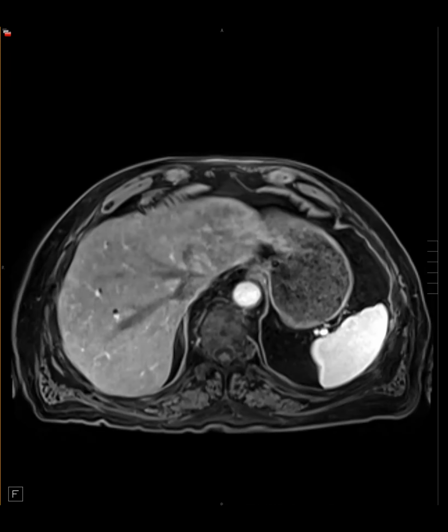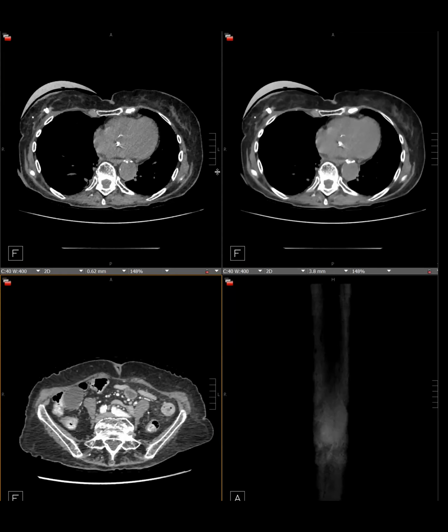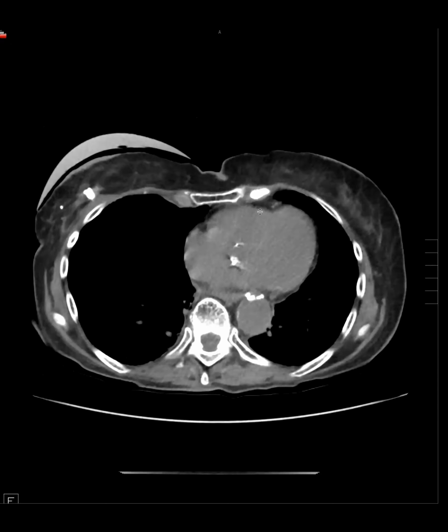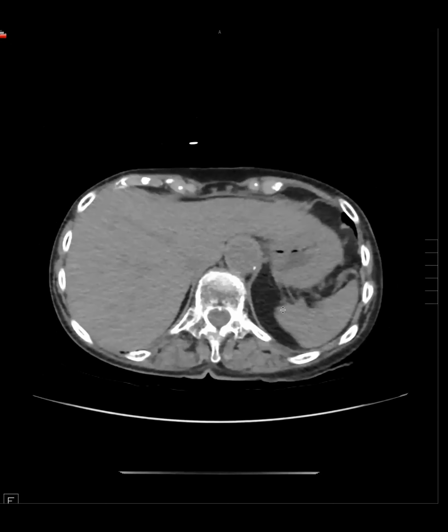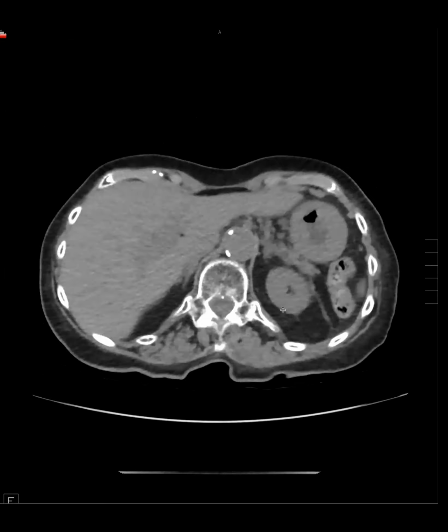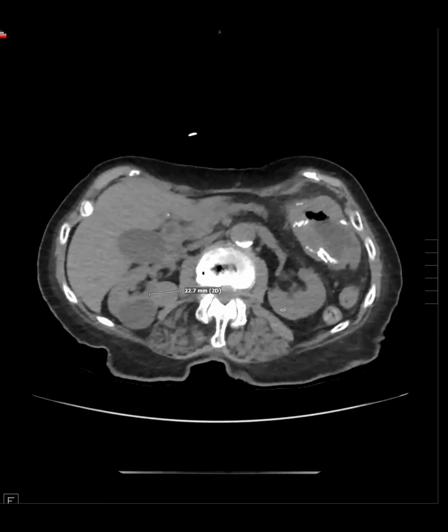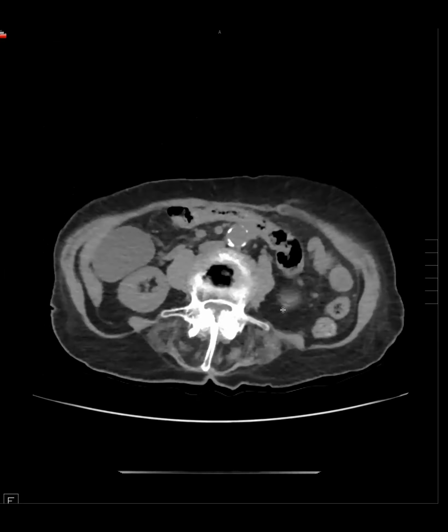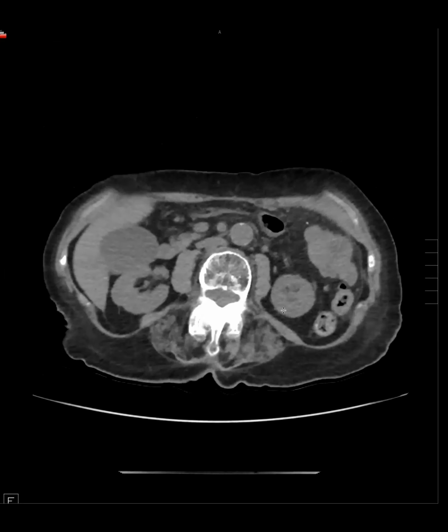Yeah, last week somebody showed a case of, what was it, blasto to the adrenal glands. Oh yeah, that's right. But I've never seen any of these. I don't have any cases of either blasto or histo or Cocci. Maybe I'm missing it. Maybe you will get more cases soon as we continue these conferences.